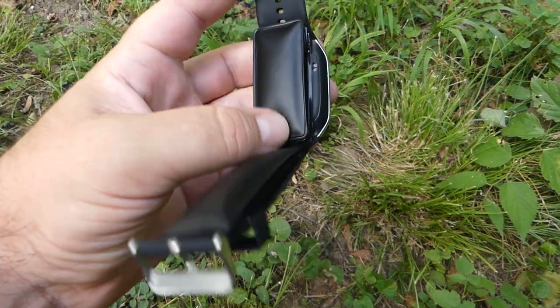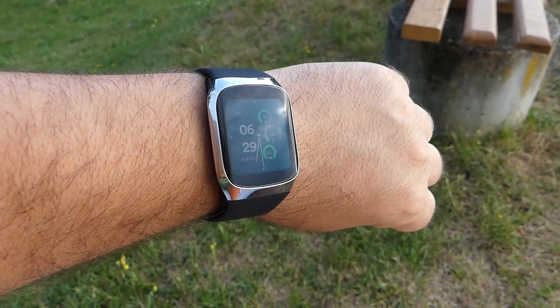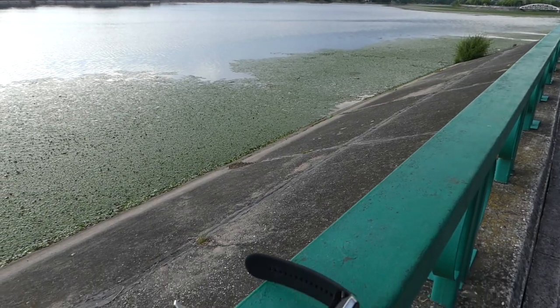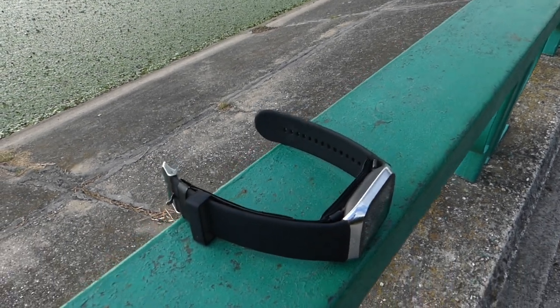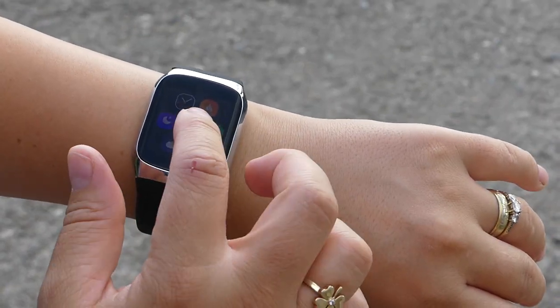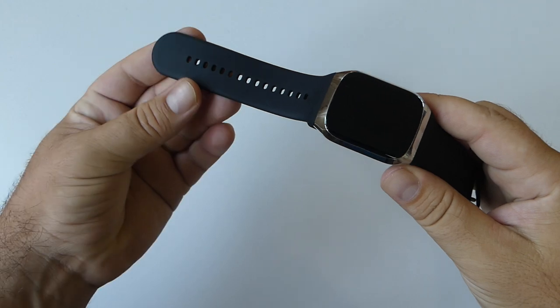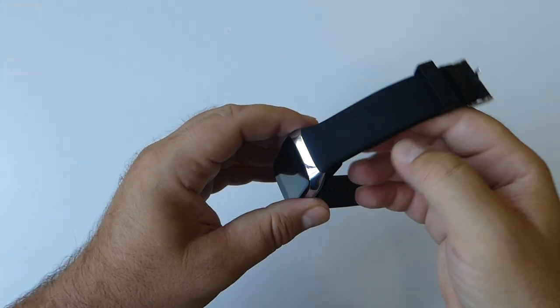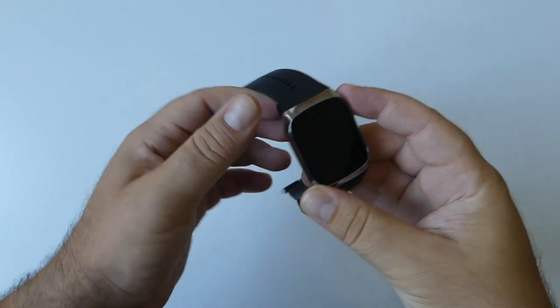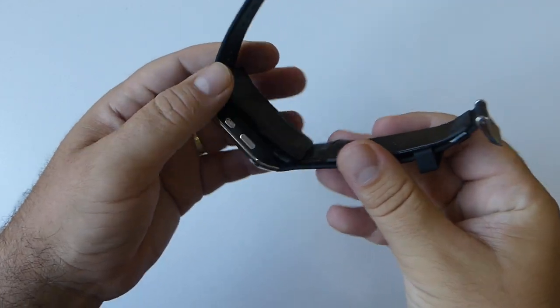BP Dr. Med features a sleek and modern design similar to high-end smartwatches. Its lightweight build — just 60 grams — makes it comfortable for all-day wear. The watch includes a customizable strap and a high-resolution touchscreen. The strap is made of skin-friendly PU material for luxurious comfort, and the color is a bright silver with a black wrist strap.